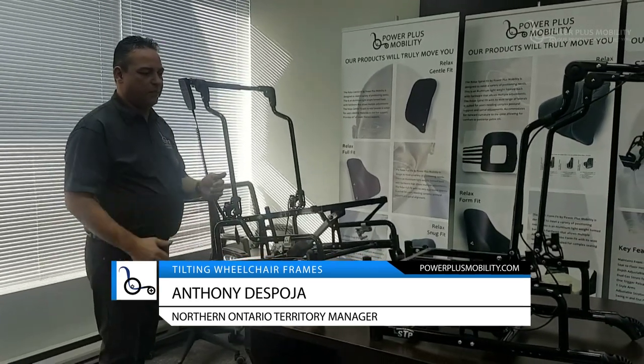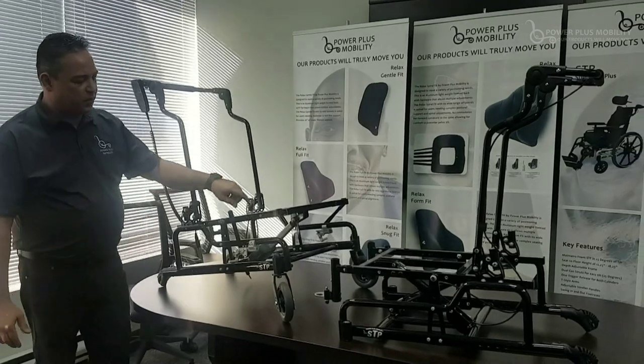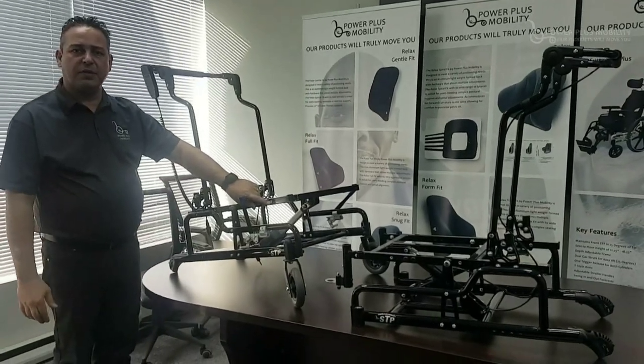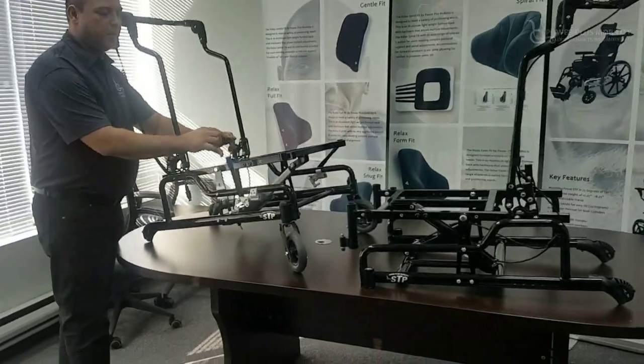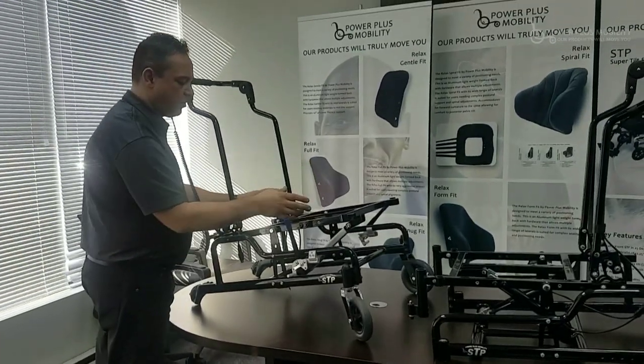Another nice option of both of these tilts is that we have pre-drilled holes for seat belt mounts. Those seat belt mounts will allow you to either put a single auto-style seat belt or a four-point harness on through there.